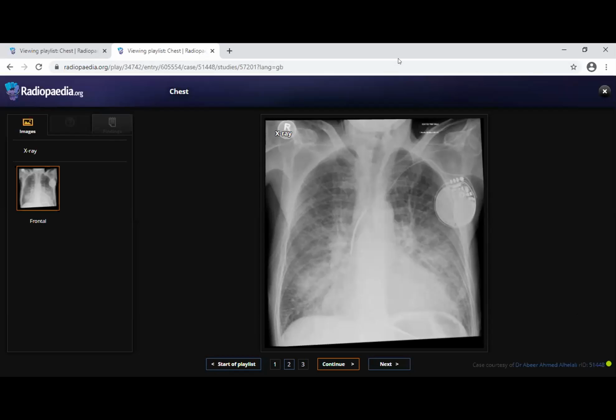Okay. Thank you very much, Dr. Manu, and thank you, Dr. Vala. It was a very good hot seat session. The only thing I would like to add is that for the case with the thyroid primary and the miliary metastases, we can always say that we would arrange an ultrasound guided biopsy of the thyroid, because we should always try to add interventional radiology wherever we can. And as you said, referral to MDTs, referral to respiratory, in general terms. Your speed was very good in wrapping up the cases. That is what we need.